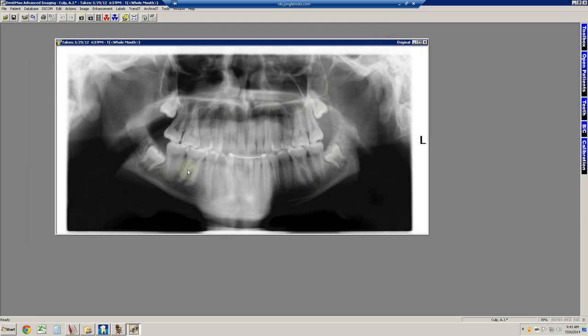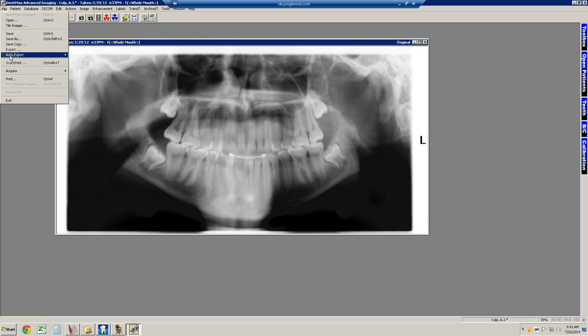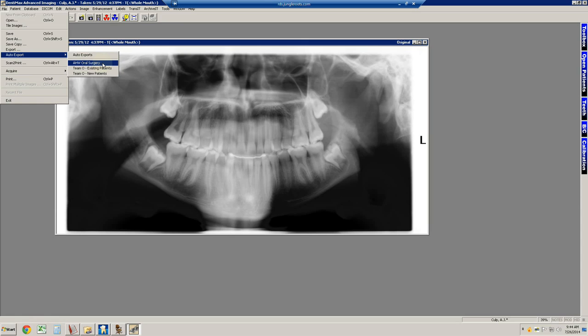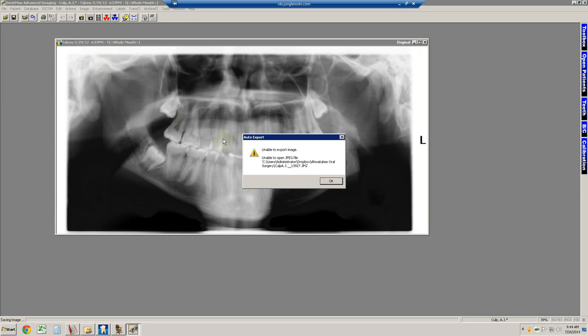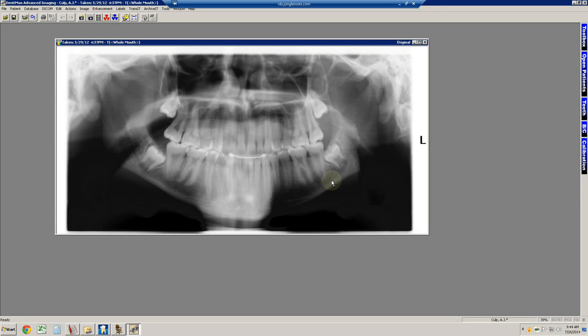What we do is we go up here. Once this image is selected, we know it's selected because this bar is a dark blue. We go up to File, Auto Export, and there is Dr. Edmonds. Awatuki Oral Surgery is his section. We have what's called a Dropbox set up for him where, when we select this option, this image, when I click the mouse, the left mouse key, is sent instantly to a Dropbox that we share.